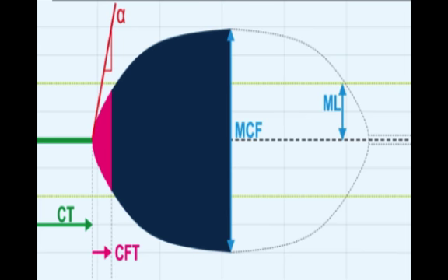Another thing that's important in how we look at this graph is that it's essentially an X and Y graph. The X-axis going through the center is time. Over on the far left, where I drew this X, is where we begin, time 0. As we progress, that's time progressing to where we start forming this clot. The Y-axis, going upward and downward from the middle, is the thickness of the clot that's developed at that point. The critical point to remember is this 20 millimeter point that we use to calculate part of our alpha angle.